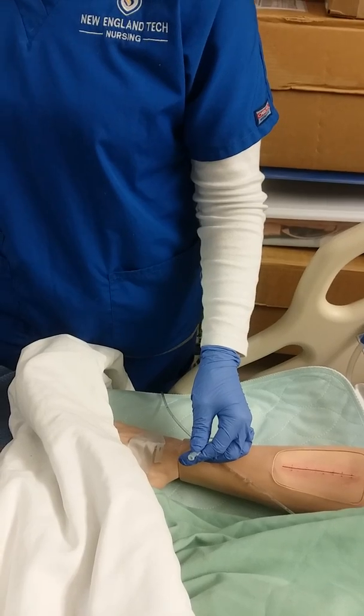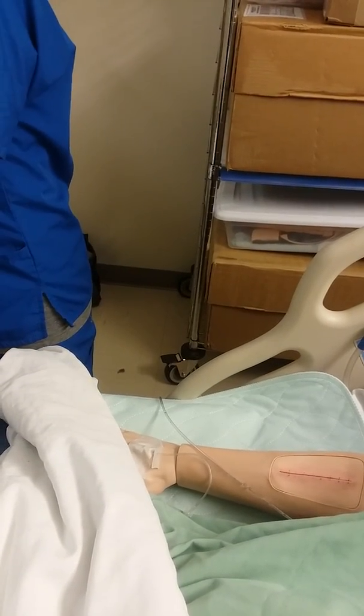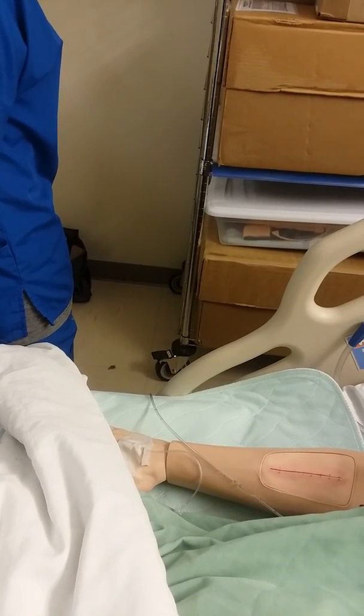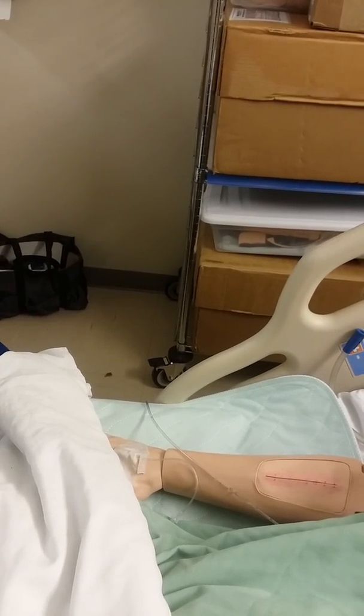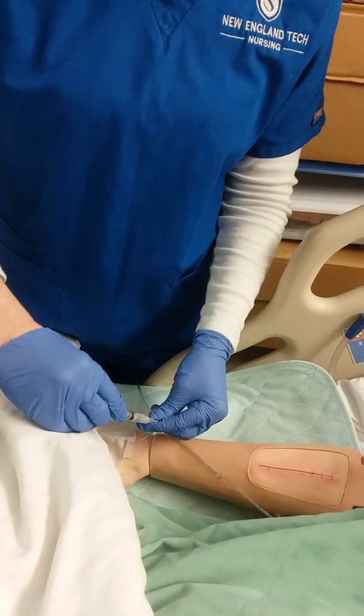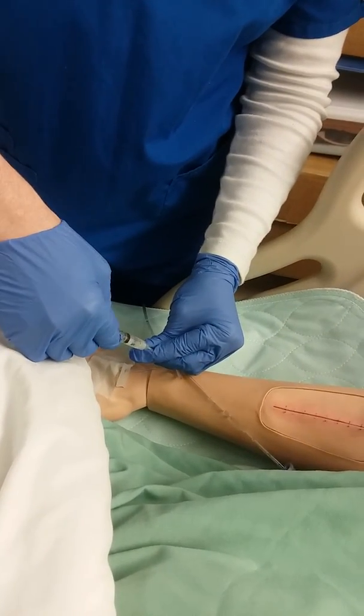At this time, I would attach the syringe, making sure to hold the port with my non-dominant hand.